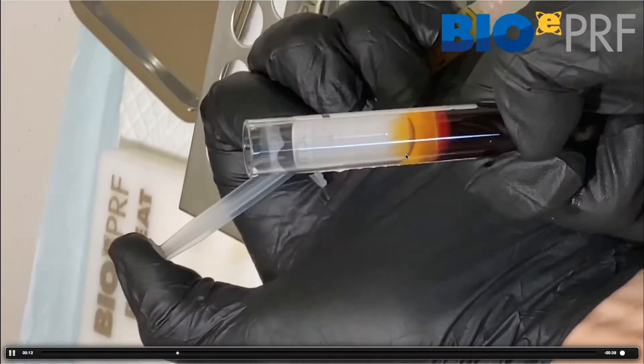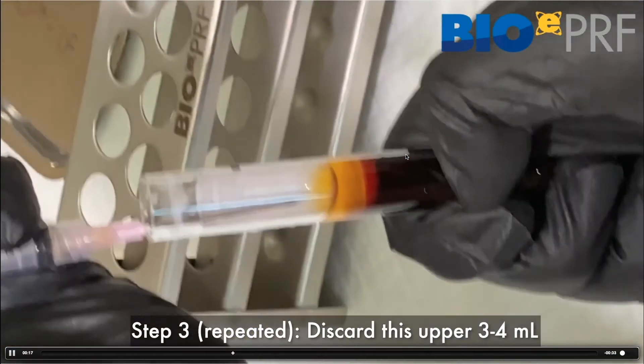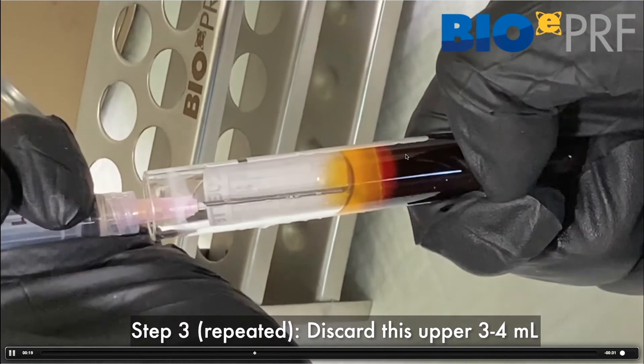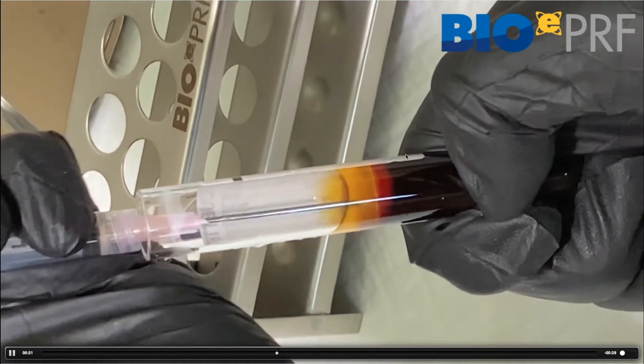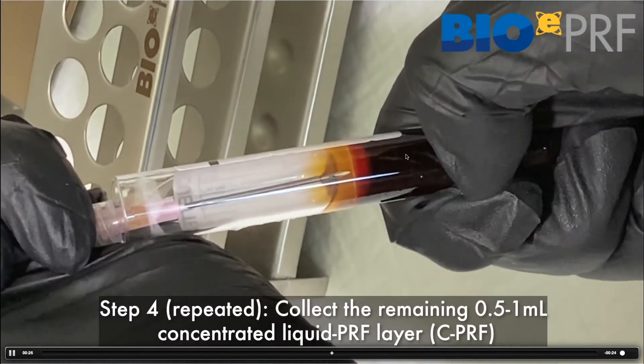You take out the top three, four mLs and then you're going to discard it. So you can just put it in the PRF bowl. When there's about one mL left, then you're going to take this very rich layer. And as we reviewed previously in chapter three, this is concentrated.